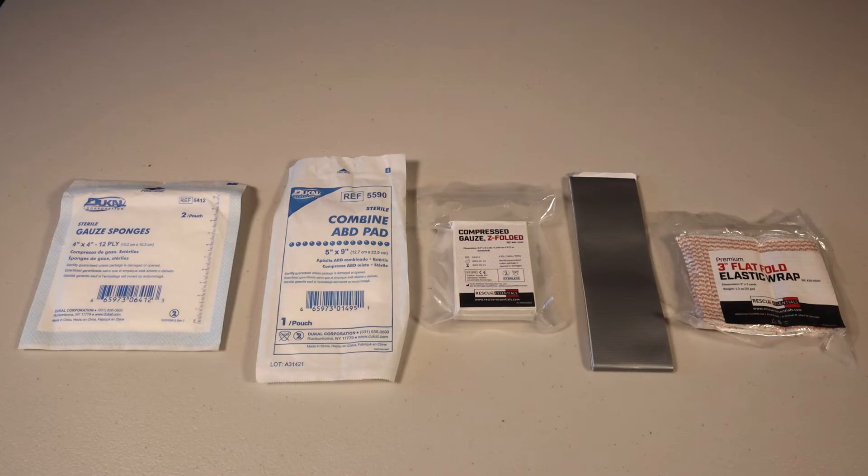Inside the wound pack you'll find the following components: four 4x4 gauze pads, a 5x9 inch ABD pad, a pack of compressed z-folded gauze that's four and a half inches wide by 4.1 yards long, 36 inches of peelable duct tape, and a three inch elastic bandage with velcro closure.